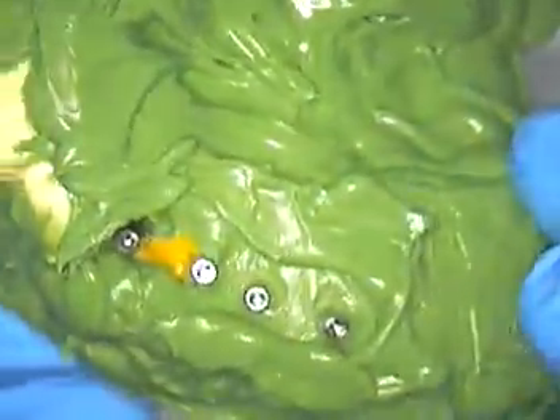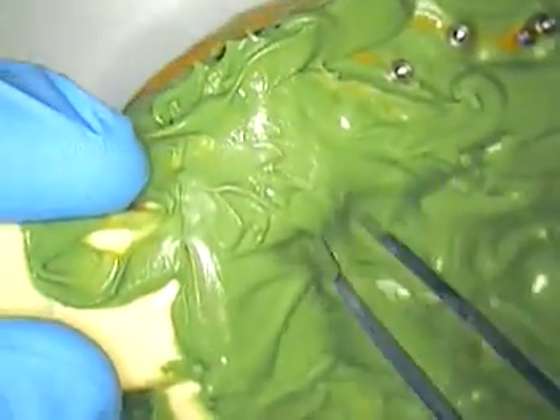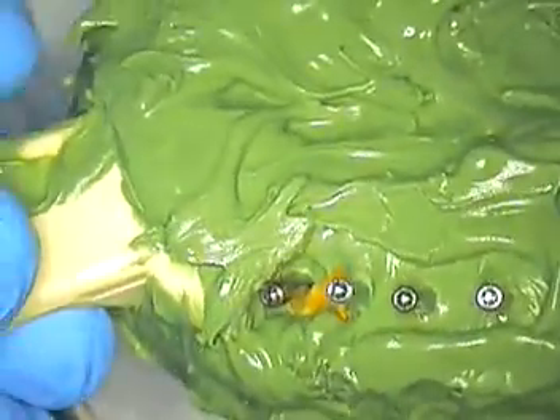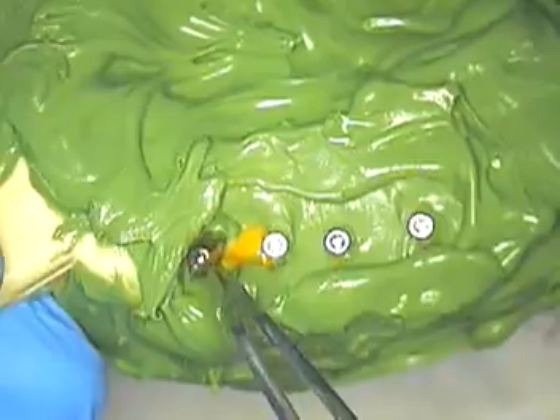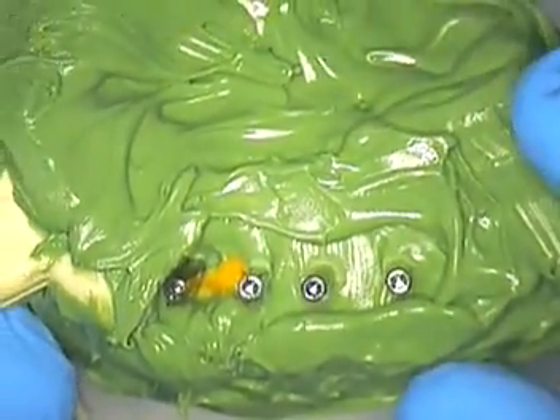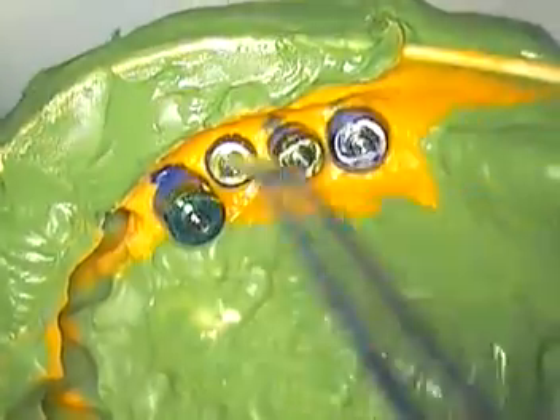I've reinforced the tray significantly with extra material well after I took my impressions, just so I have something that's not going to be a problem when we do the pour-up. Here are the four impression screws — these are the ones that are tightened down. Just hand tighten them gently down and then loop the other side.